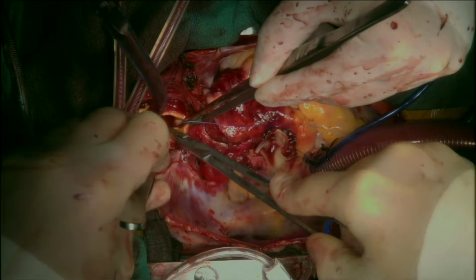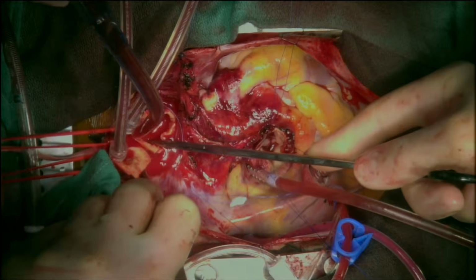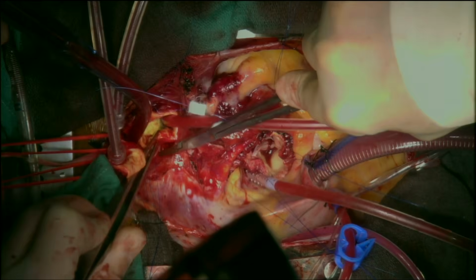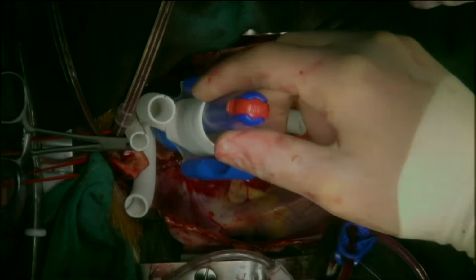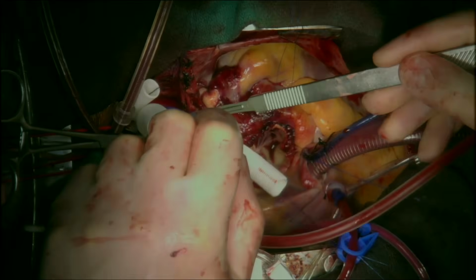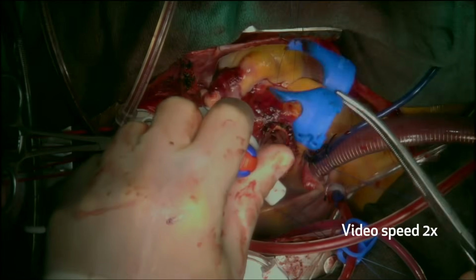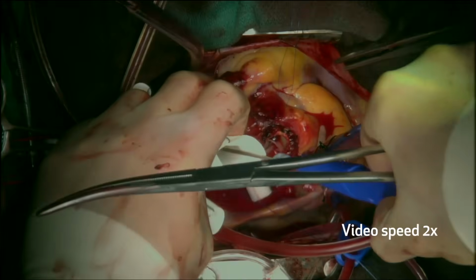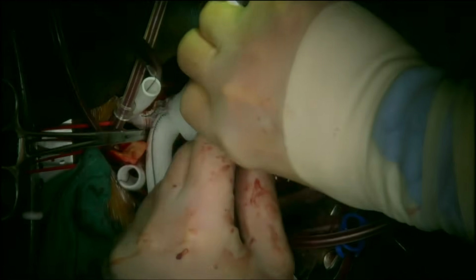Pledgeted Prolene sutures were used to tack down the intima and to use as a handle for the distal cut end of the aorta. A 30 to 34 millimeter by 10 centimeter ThoraFlex Hybrid graft was deployed in the true lumen of the descending thoracic aorta. The stent graft was stretched with a Satinsky clamp.